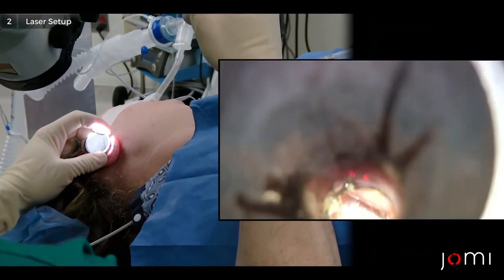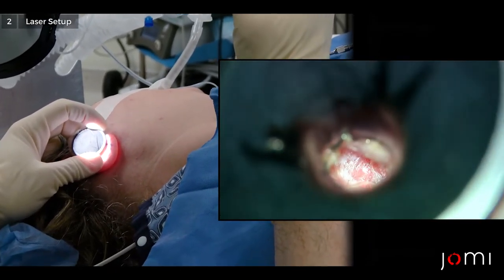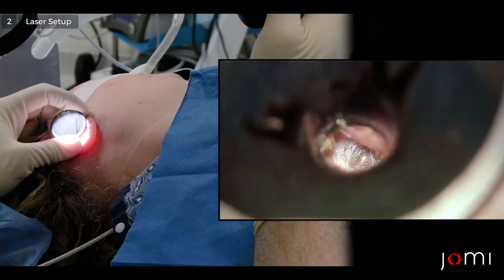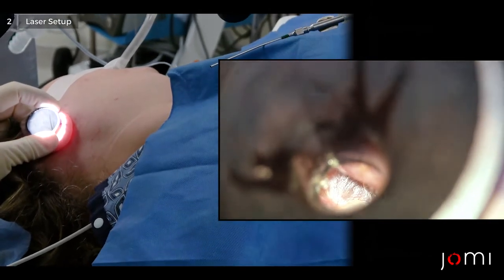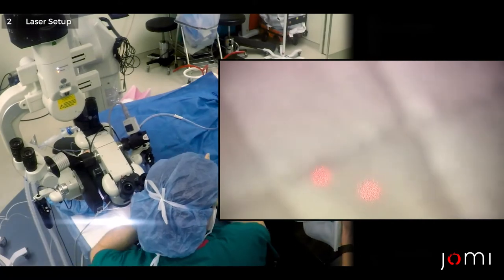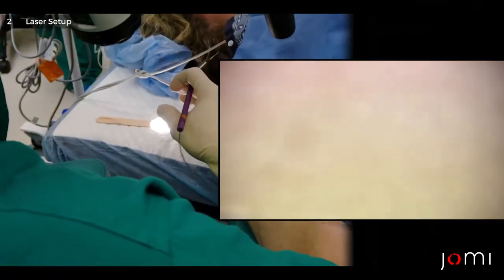What we can see is the eardrum right there — when the laser light goes off, you can see it's hyperinflated. First I'm going to test the laser, so can I have a stick? Does everyone have goggles?